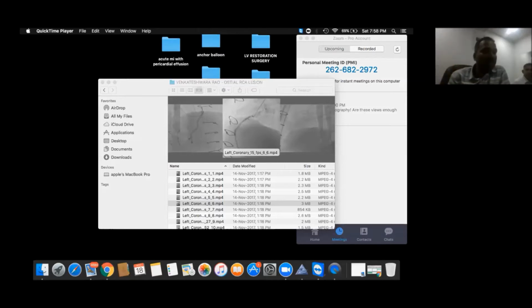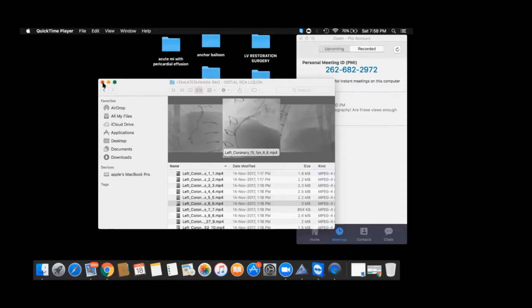Then take your stent and position it exactly with your reference frame, and deploy it. So IVUS helps you a lot in locating the ostium in these kinds of ambiguous ostia. I think now you understood why the art of angiography is important in treating patients. This is a clear-cut case of foreshortening and overlap because it is not a normal origin RCA.